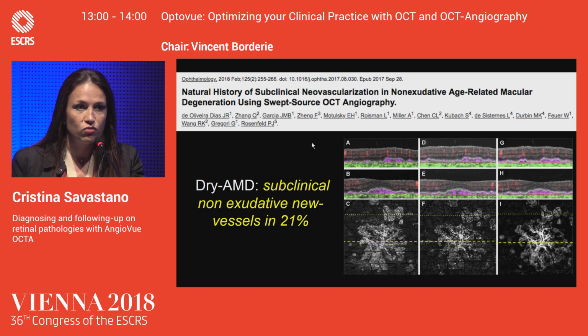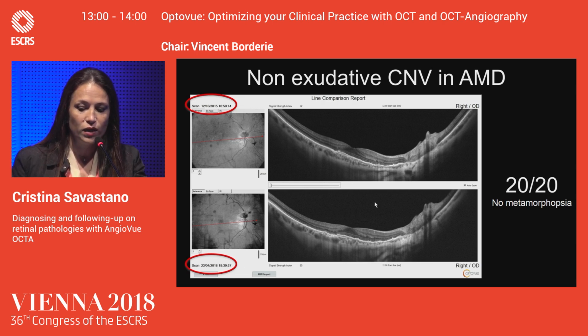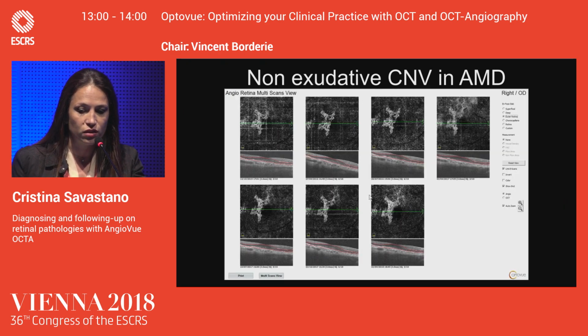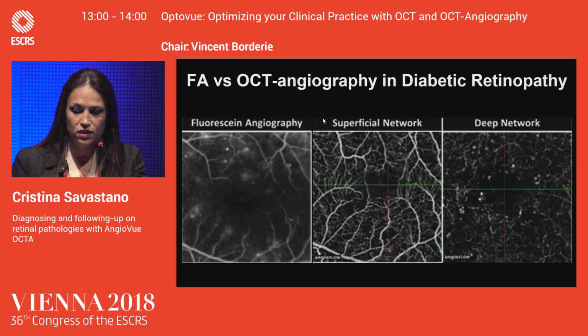Because recently, Rosenfeld and his collaborators described in dry AMD patients subclinical non-exudative new vessels in 21% of cases. In fact, by means of the OCT angiography, we were able to observe this new entity of CNV that are defined non-exudative. If we observe these two scans that are performed in 2015 and 2018, we can see that there is no difference between one another. Here we can observe non-exudative CNV in the same data. And this is a new entity that was observed only by means of OCT angiography.